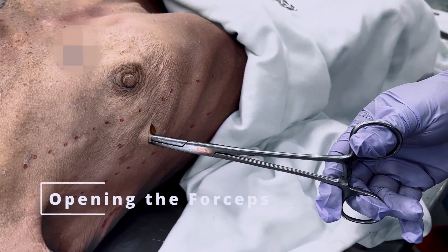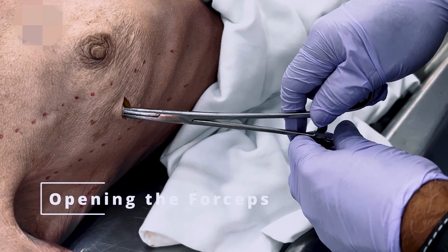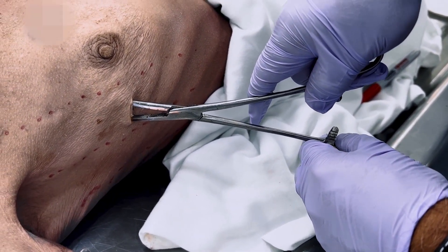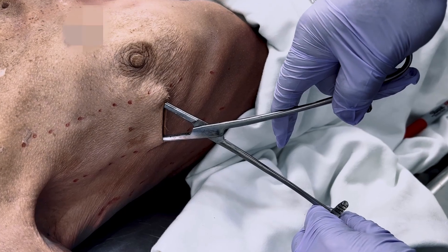Hold the hinge point of the Kelly forceps with your non-dominant hand, then open the forceps with your dominant hand, being cautious to avoid letting the instrument migrate into the chest.